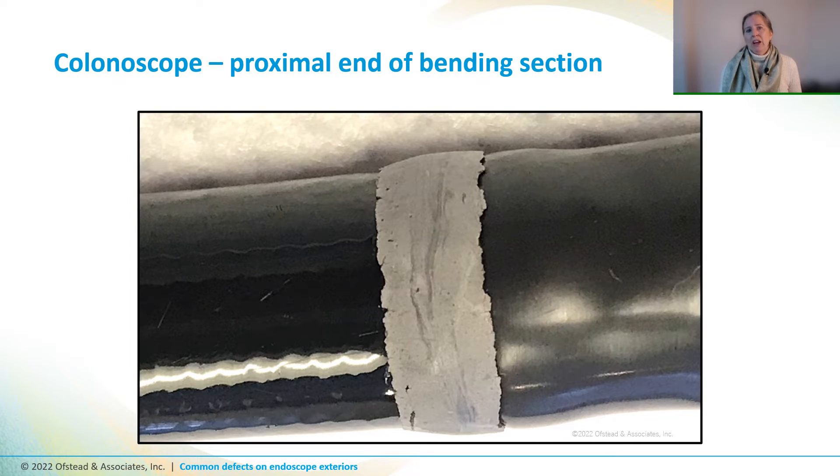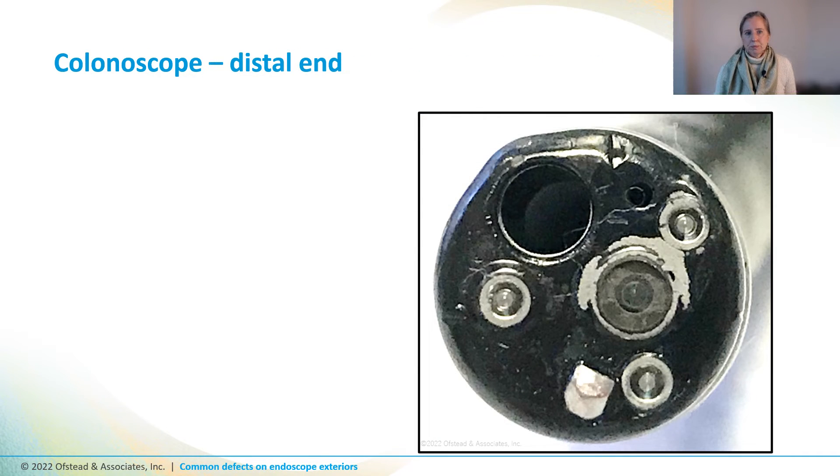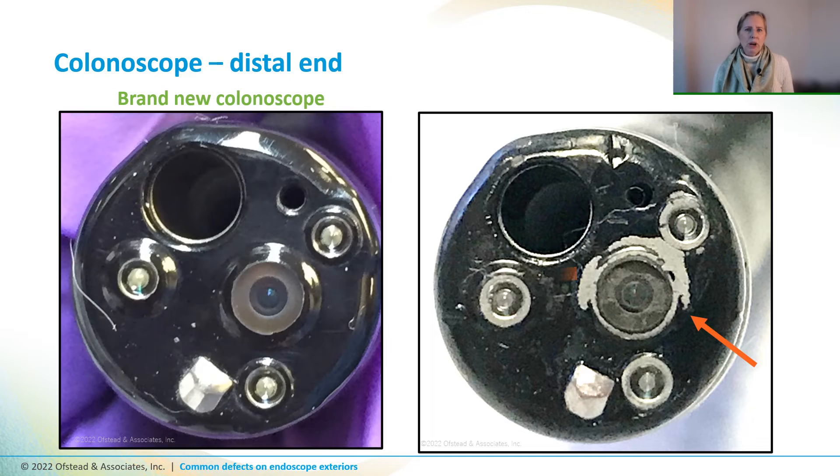This is the adhesive band on the other end of the bending section for this scope. Gray adhesive bands on Olympus scopes often are starting to disintegrate and may not be intact and smooth anymore. Now here's the distal end head on — the adhesive around the lens is gray and chunks of it appear to be missing, and the lens itself looks kind of foggy or dirty when compared to the appearance of a brand new distal end.